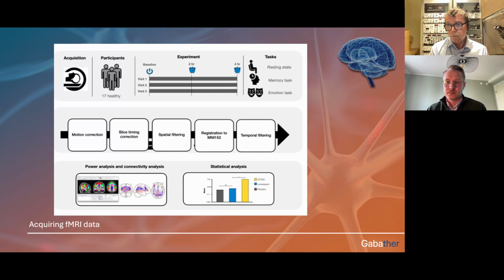They are actually pioneering and driving very much forward both quantitative and high density EEG, because you can think the more electrodes you can put onto one skull, the more data you can acquire.